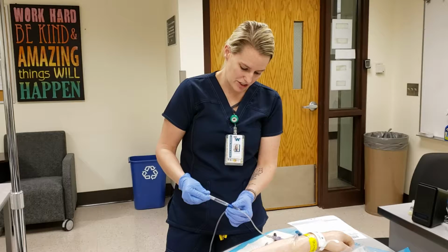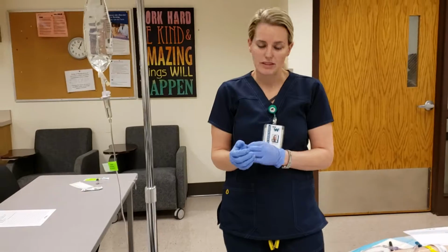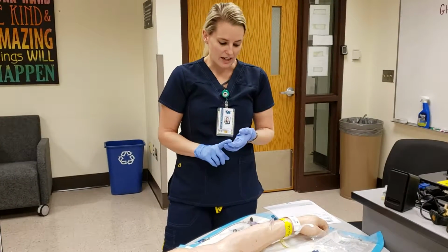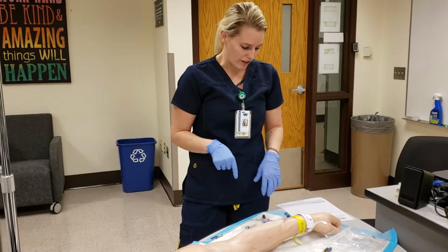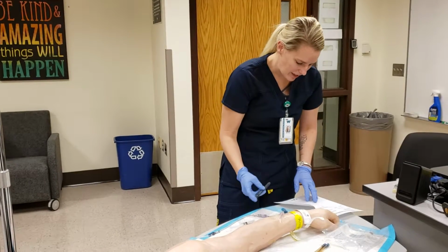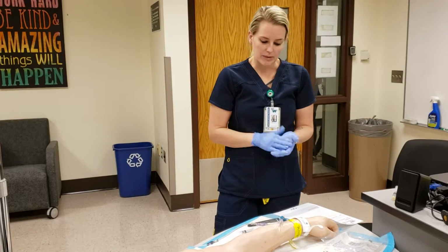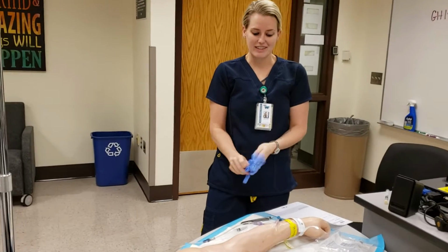So now that I've flushed, I can go ahead and restart my IV fluids at 200 milliliters per hour, making sure that I come back in 30 minutes to reassess my client's pain. I will document start and stop times of the IV fluids, and I would document start and stop time of the morphine on my MAR here. And then I would also initial here at the bottom and sign my name, since we need to have our name and initial. I would also document how the client tolerated the procedure and document the pain assessment afterwards.